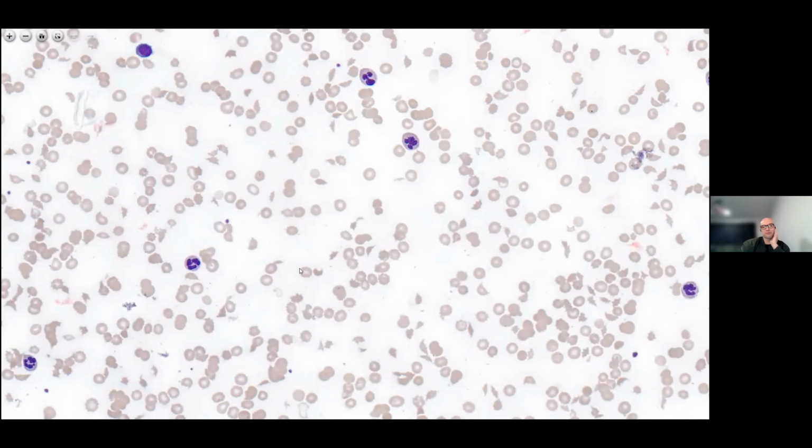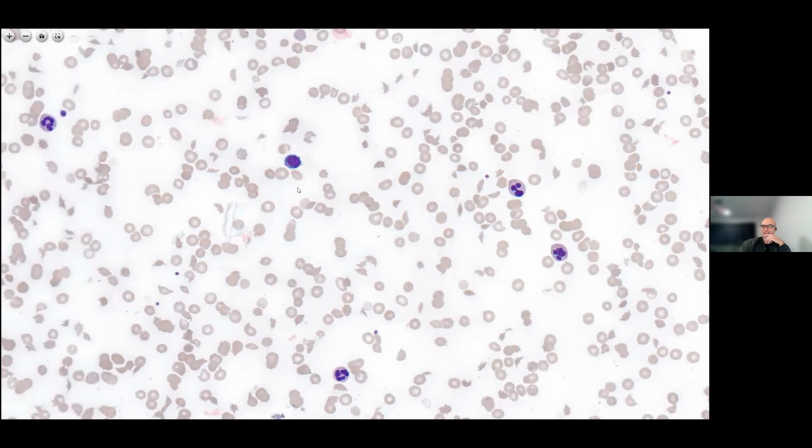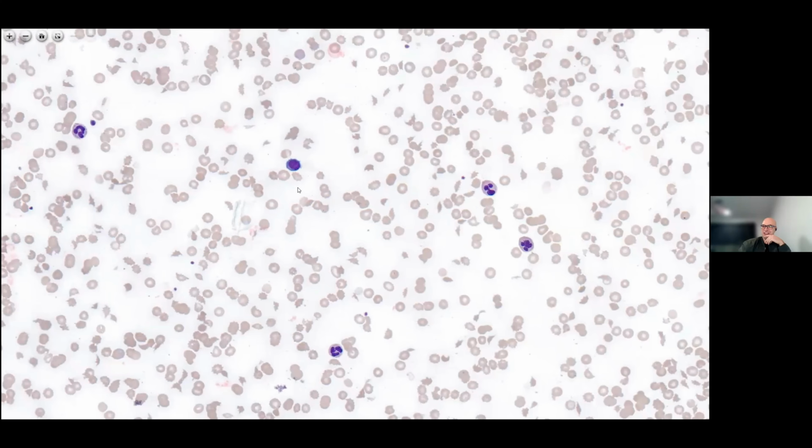Yep. One interesting question really is, we noticed some red cell agglutination. Is that significant, or could that just be due to where we've sat on the film? It could just be not looking at the right spot on the film, but yeah, that's a keen eye. I completely overlooked that. Kudos to the person that pointed that out.